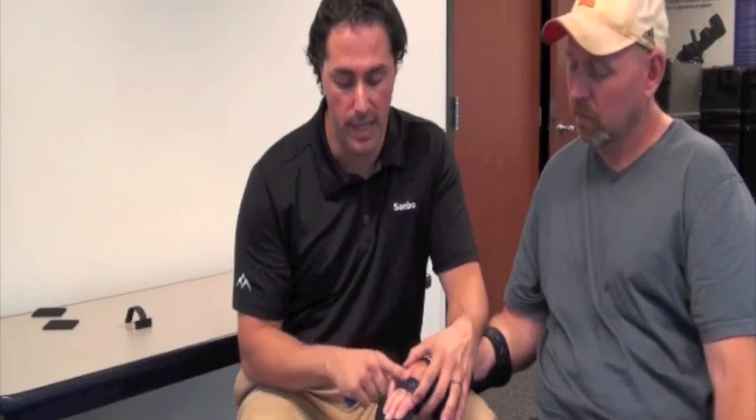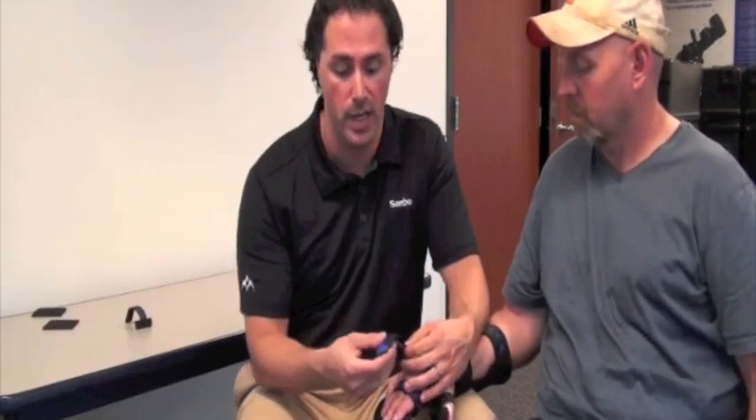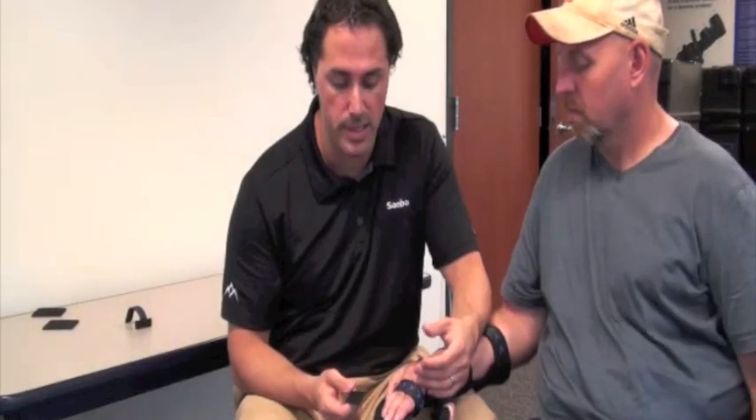If you have a strap that goes over the joint, that could unfortunately cause hyperextension to the joint — so we don't want that. Have one strap proximal to the joint and one strap distal to the joint. Also, Tony is using a large splint, so we don't need to trim the straps.